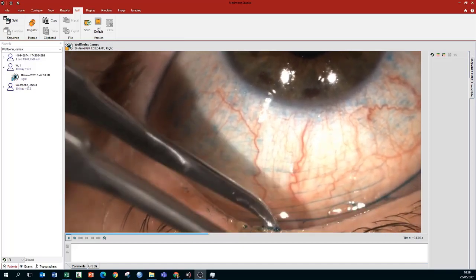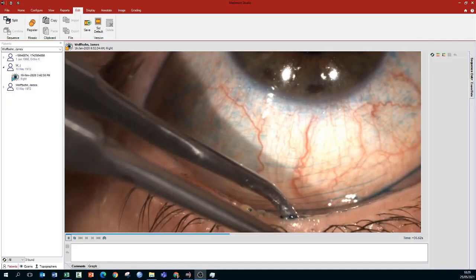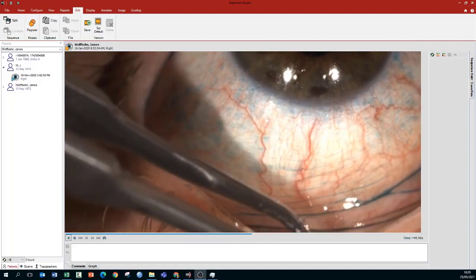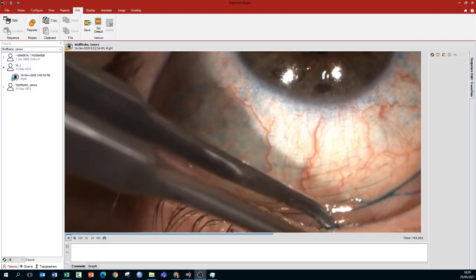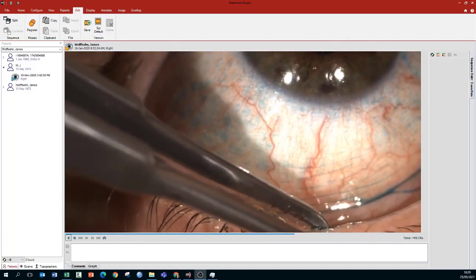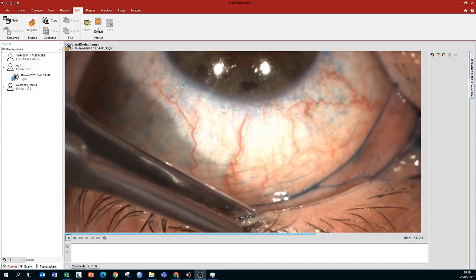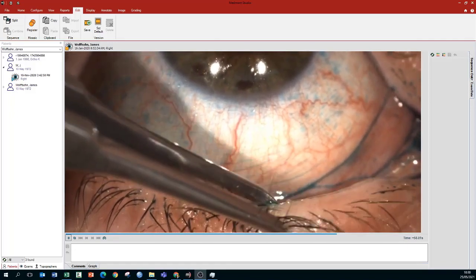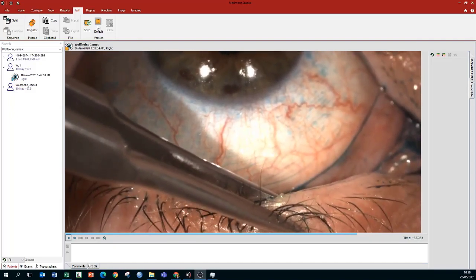And again, I'm not sure how clearly the video is coming through to you, but this is excellent quality video, certainly on my screen. And you can see the meibum coming through in terms of the oils onto the ocular surface. So again, as I said before, really powerful communication tool with our patients, but also really important for us in terms of saying, yes, this is an evaporative form of the disease, and likewise that things like warm compresses or in-office treatments with intense pulsed light therapy, some of the new technology, LipiFlow, would benefit this patient because of the state of their glands.